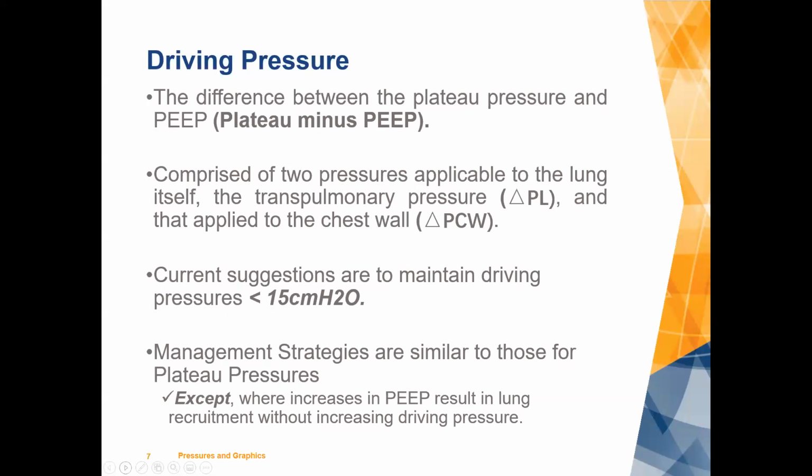In some cases, you can actually increase PEEP, increase your baseline, and what happens is you're recruiting lung. You have recruitable lung, and your driving pressure will not increase concomitantly. It may not increase at all. It may stay stable, because you would think your driving pressure would increase, but in some cases where you're recruiting that lung, the volume is able to go somewhere. You now have more area in which you're putting that tidal volume, and according to Boyle's law, you're putting the same volume into a greater capacity, so the pressure should basically come down.